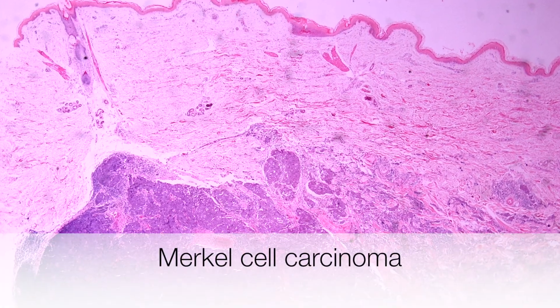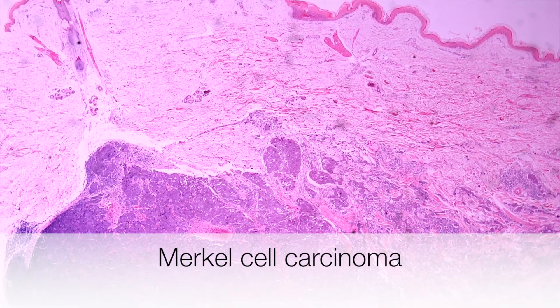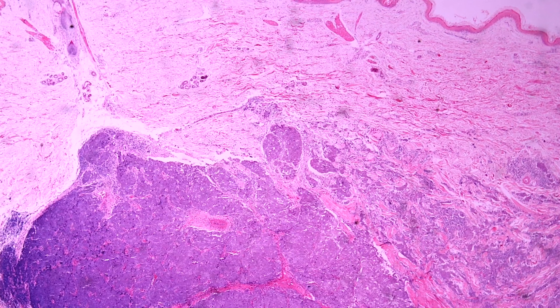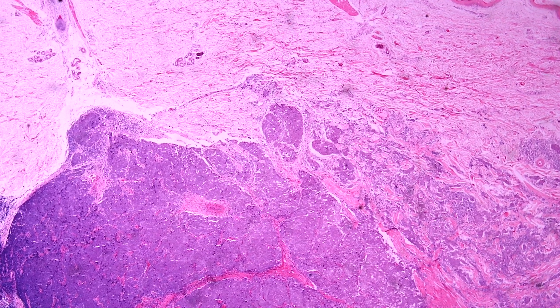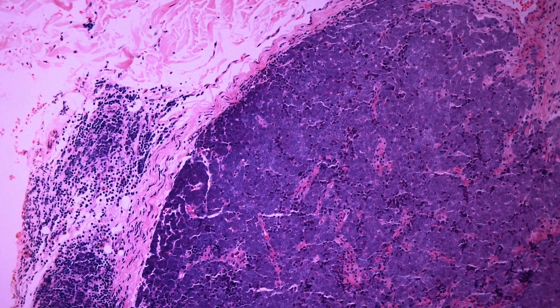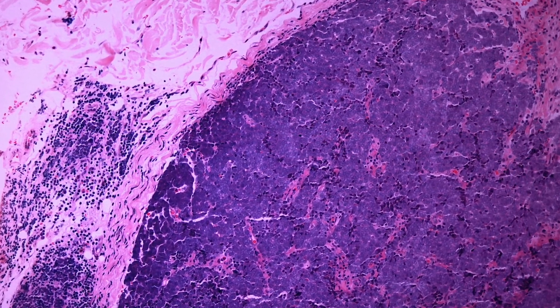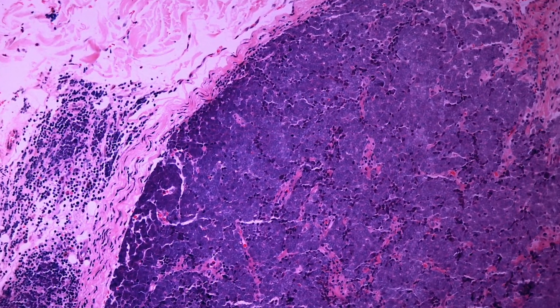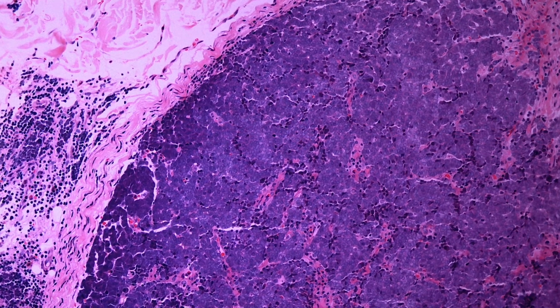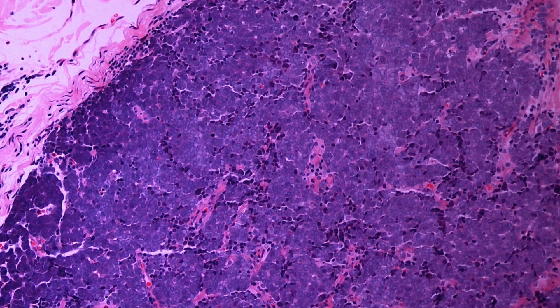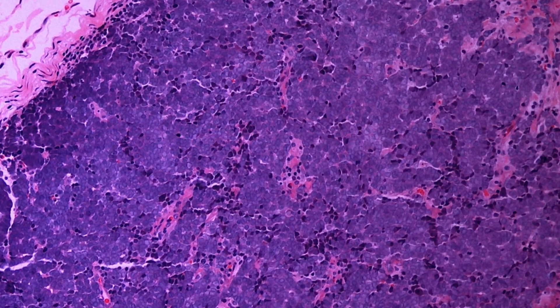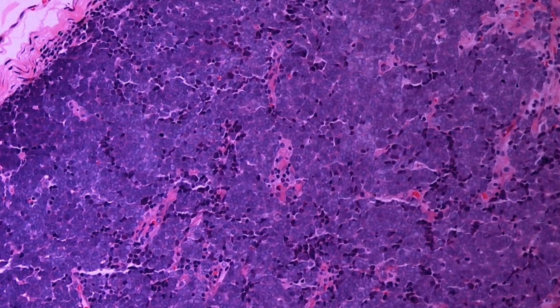This low power view shows the Merkel cell carcinoma deep in the dermis. Looking at the tumour at a higher power you can see that the cells have a neuroendocrine type of appearance, similar to small cell carcinoma of the lung for example.